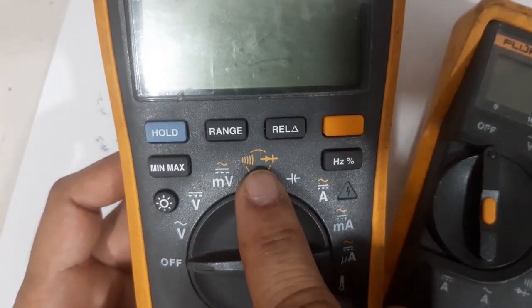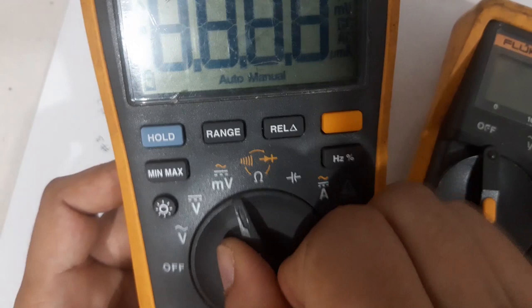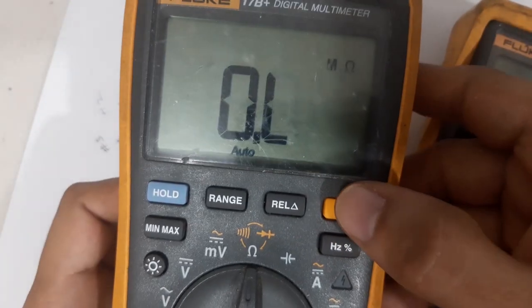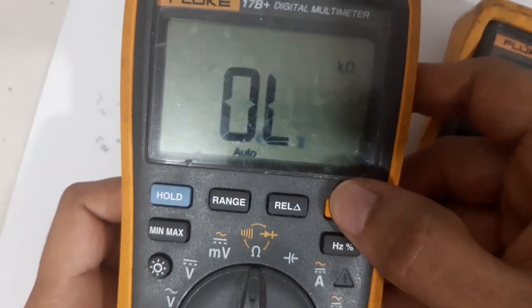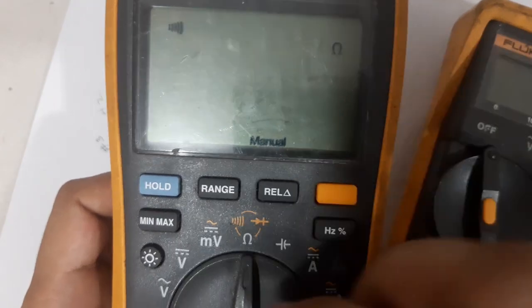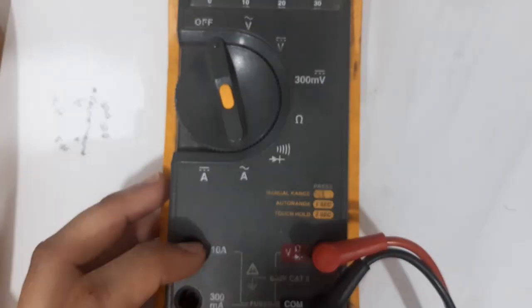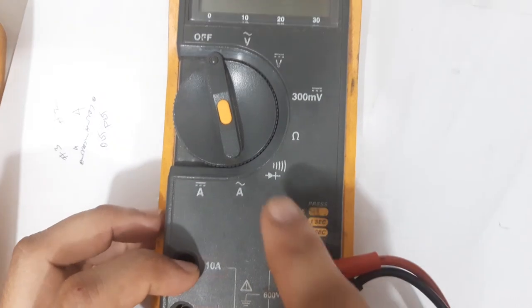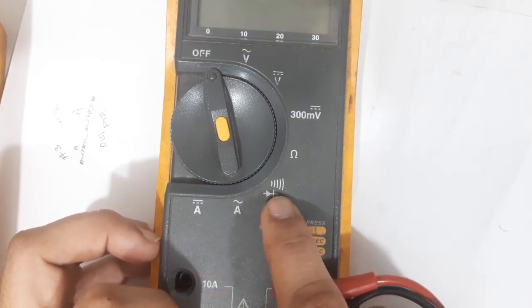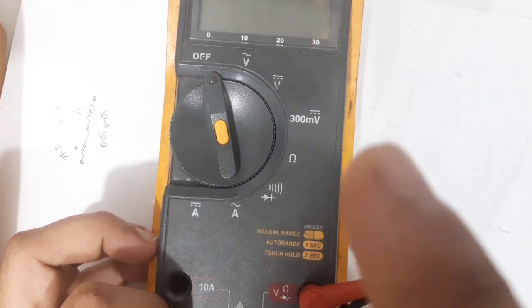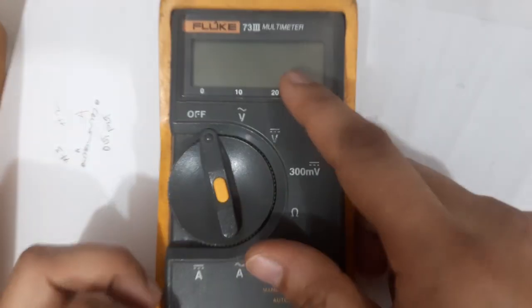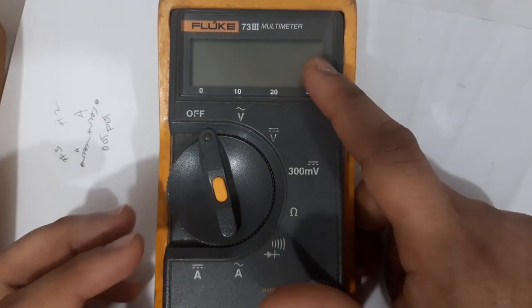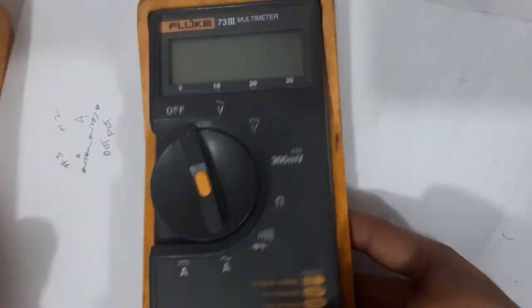On this newer model, the continuity and diode mode are separate. If you shift, you need to press this button. The advantage of this one is you can check the short even without looking at the multimeter. You will hear the beep.